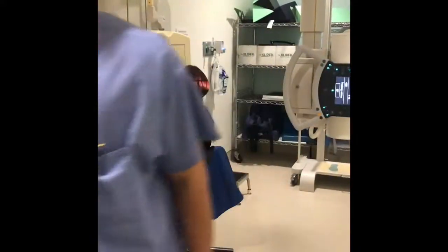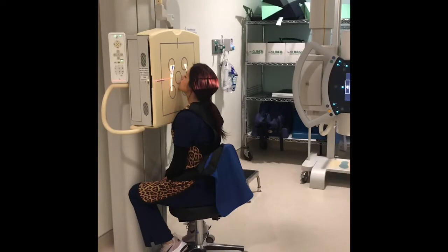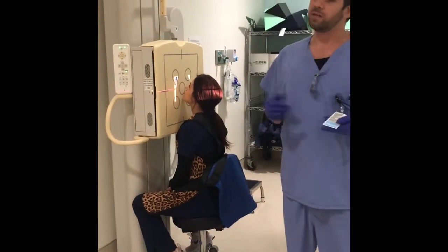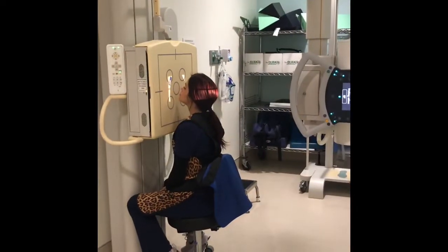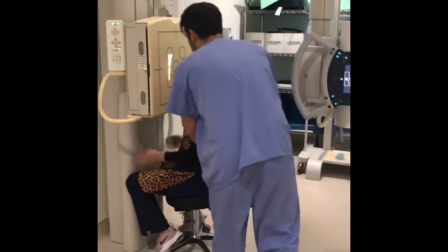Left marker. All right. Hold your breath. X-ray. And for that one, again, I forgot if I mentioned or not, but I'm using about 75, 10, or 12 throughout the first three. All right, you can go ahead and relax your neck, and we're going to turn you around again.